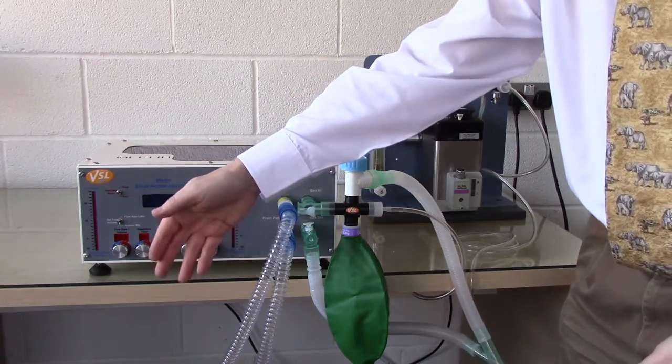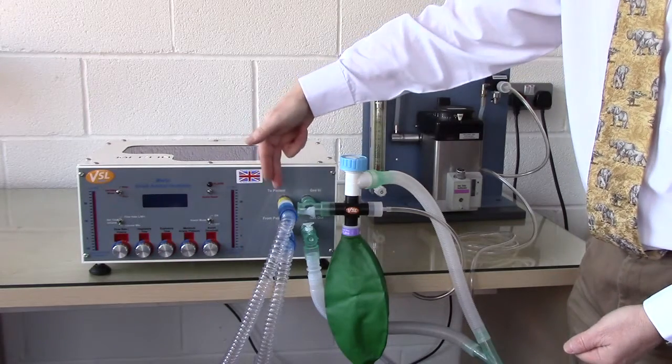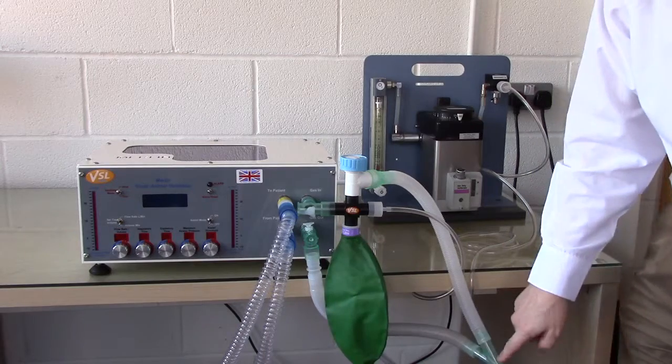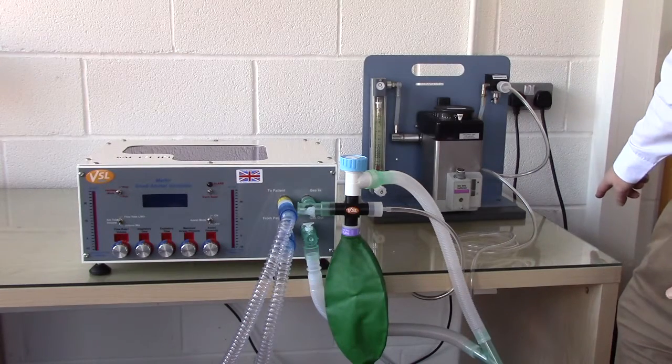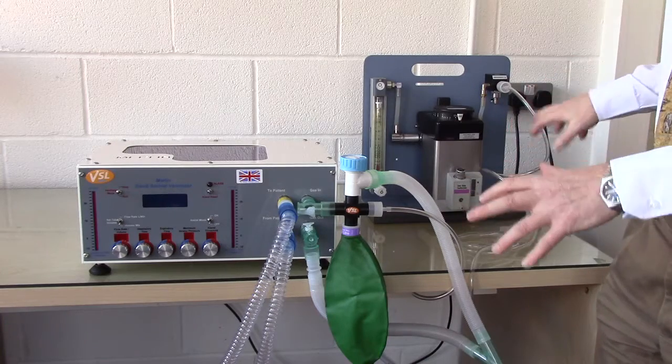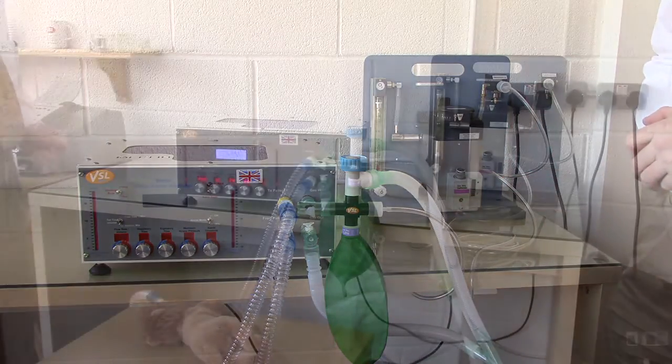When Merlin ventilates the animal, gas passes to the animal and comes back into Merlin through the from-patient port, and then out through the exhaust port into the common waste gas tube. This is the standard setup for a non-rebreathing system.